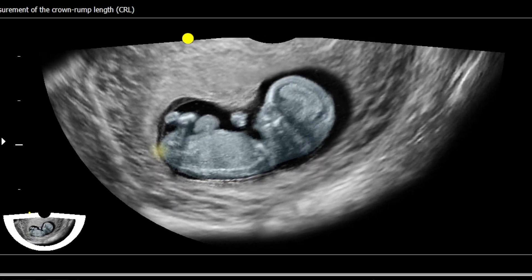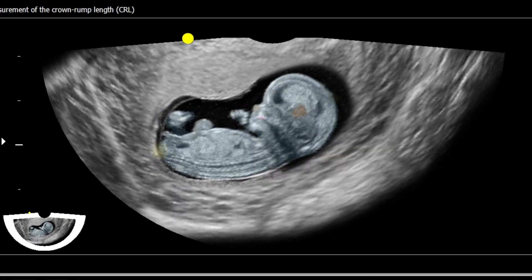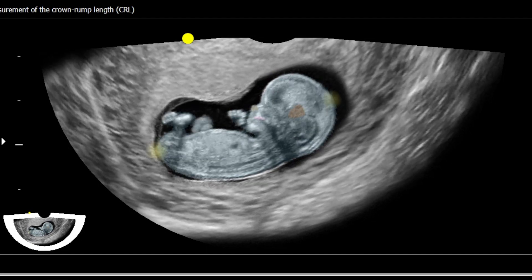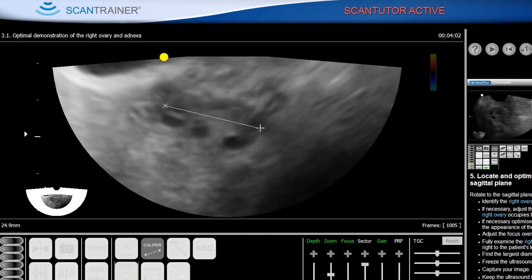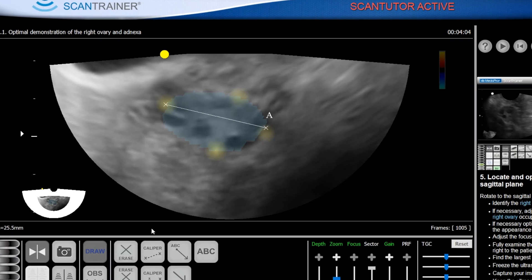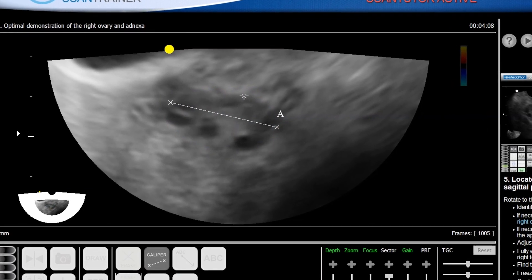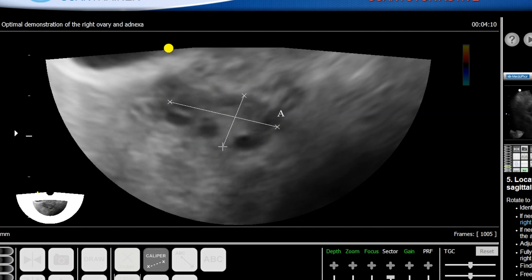ScanTutor guides trainees through tasks by highlighting the structures required for views. On-screen spheres indicate correct positioning of calipers when measurements are being attempted.